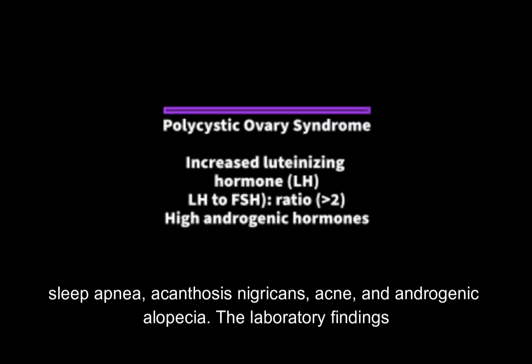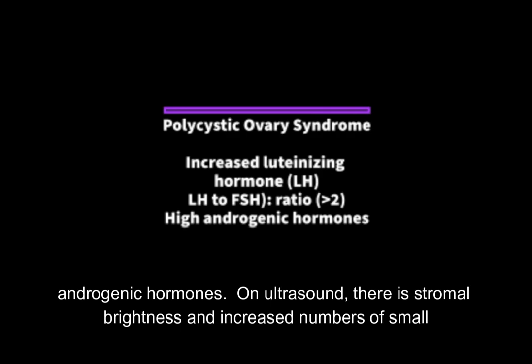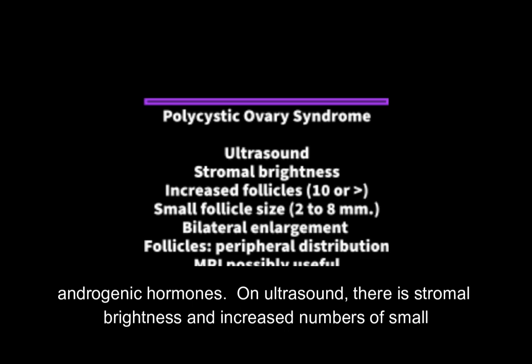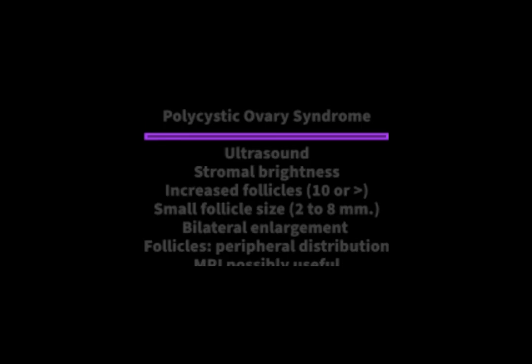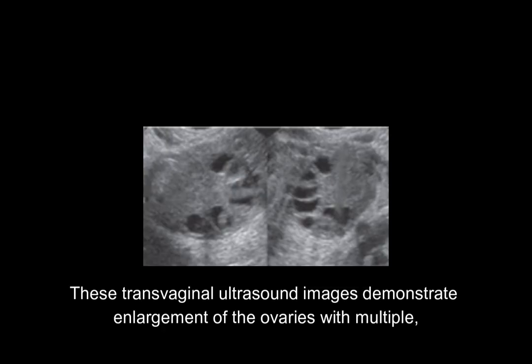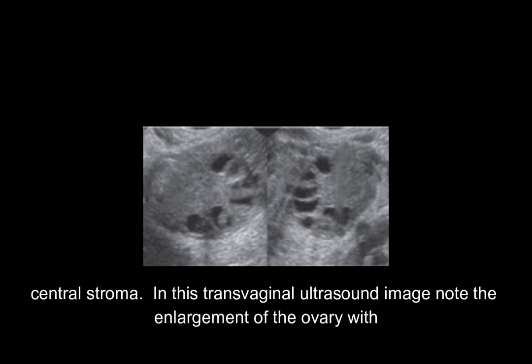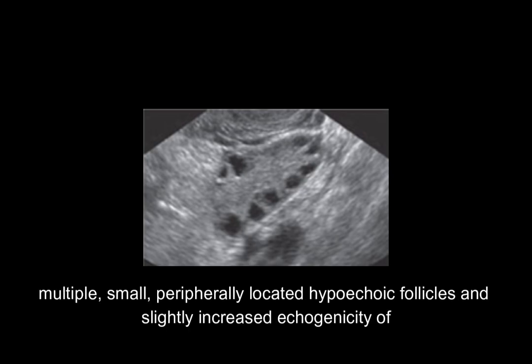Laboratory findings indicate increased luteinizing hormone, an LH to FSH ratio of greater than 2, and elevated androgenic hormones. On ultrasound, there is stromal brightness and increased numbers of small follicles with bilateral ovarian enlargement and peripheral follicle distribution. MRI may be useful. These transvaginal ultrasound images demonstrate enlargement of the ovaries with multiple small, peripherally located hypoechoic follicles and slightly increased echogenicity of the central stroma.